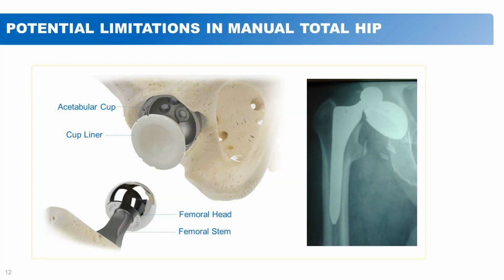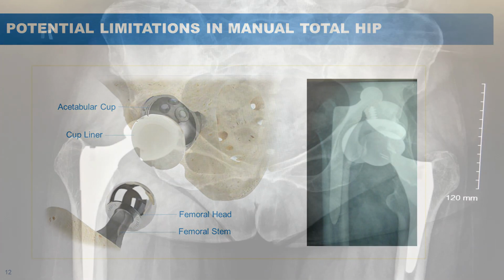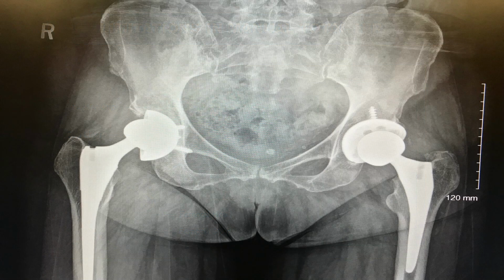And so here are several examples in my own practice that have come about in the last few months to years. The next slide looks at a dislocation, where the ball actually pops out of the socket. Depending on which approach, with the posterior approach about 5% of hips may dislocate or have some instability. The anterior approach is not as much. If you look at the next slide, this is an example on the right-hand side where the cup is put in very vertical. This patient has been dislocating on the right for probably the last 4 or 5 years. The left one was done with our robotic technique and has been very stable, and the patient is looking at having a revision now on the right side to properly align the components.